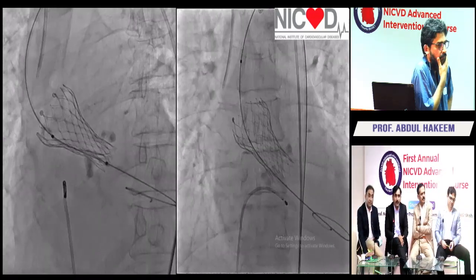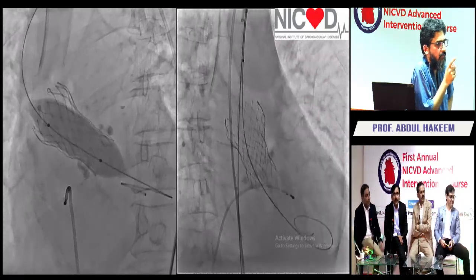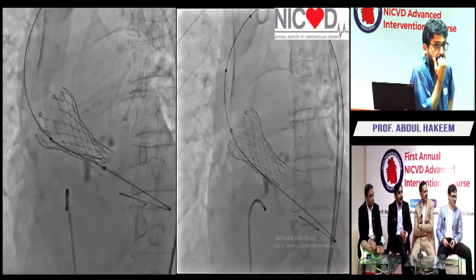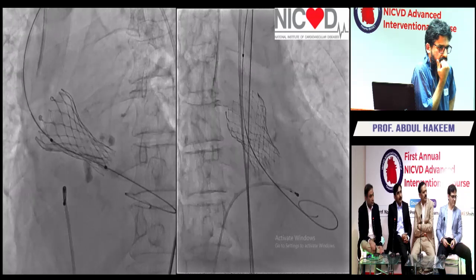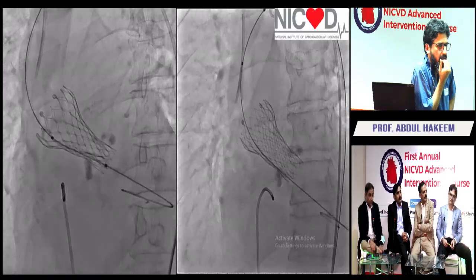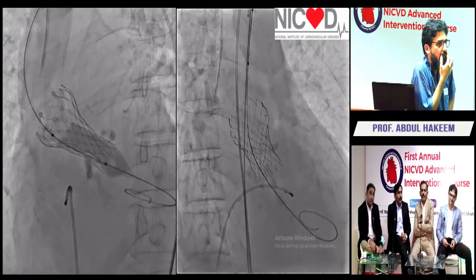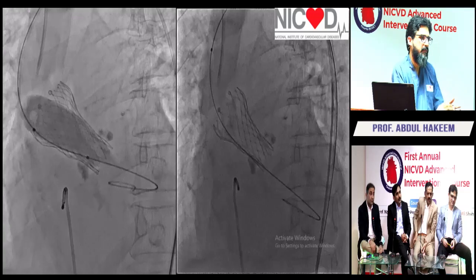You have to check first. I'm just asking. No, let's finish that thought. This is just for the thought which is coming. Maybe it is valid or not. You can just have your experience accordingly. I mean, is it possible if your valve is still in the aorta, you can just pull it back a bit and then deploy it somewhere in a decent position? Where? What's the decent position? I'm just asking, is that possible? Because rather than leaving a free valve, I don't know.